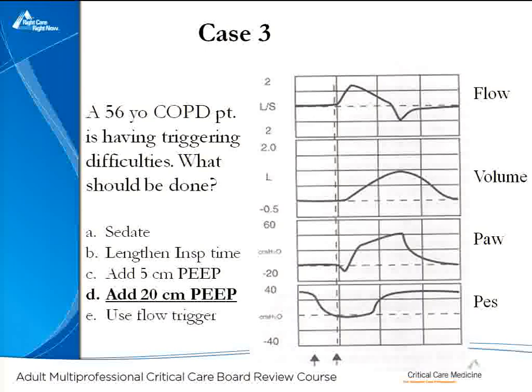And we've got all kinds of answers, except nobody liked mine. So what's going on here? Let's dissect this a little further. Here's the esophageal pressure, and here's the airway pressure. Now, what did I tell you earlier?